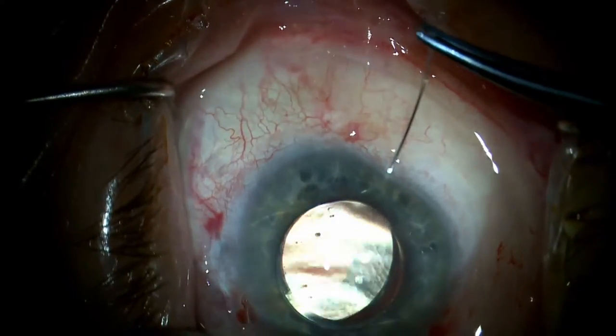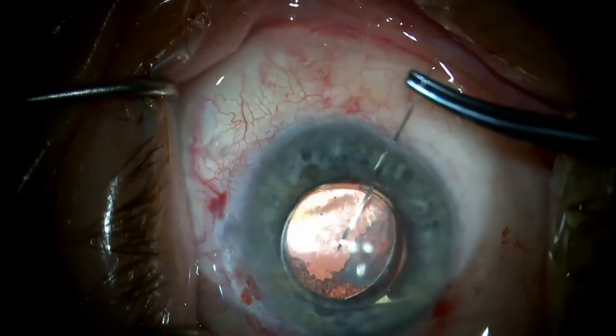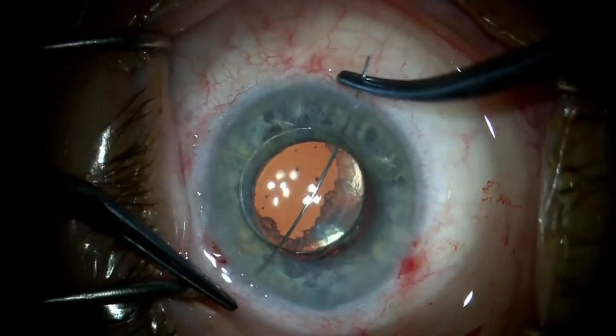A long curved trans-chamber needle, CTC-6L, is then passed through the limbus, under the optic, and then partially out through the limbus on the other side of the eye.